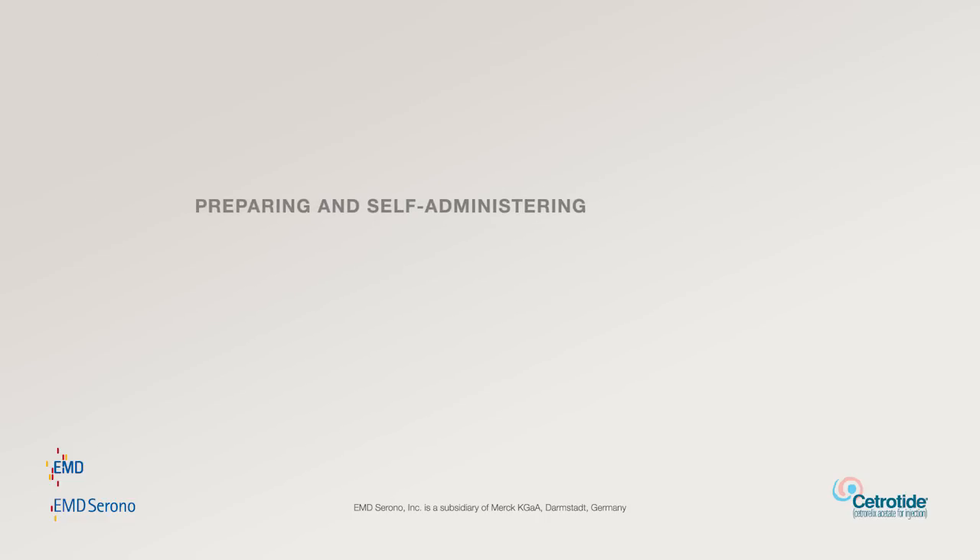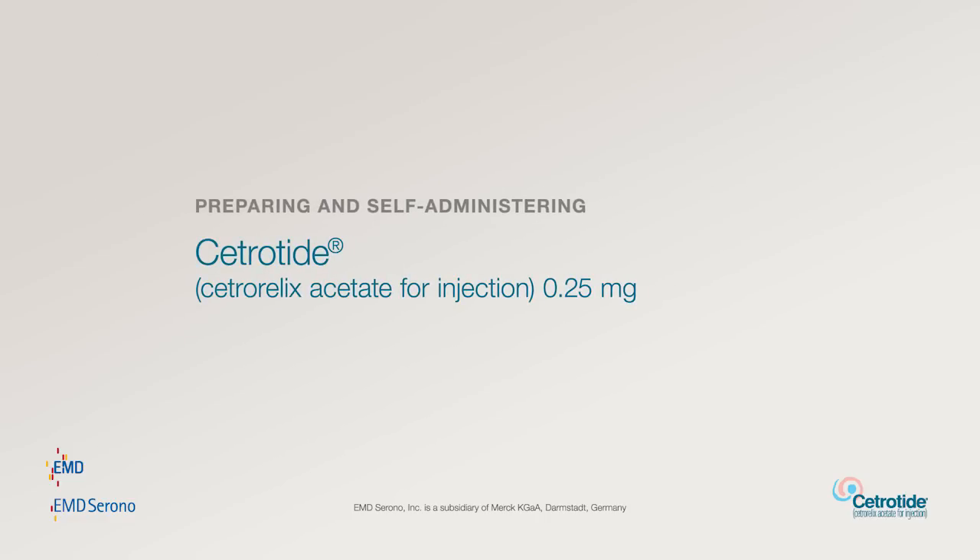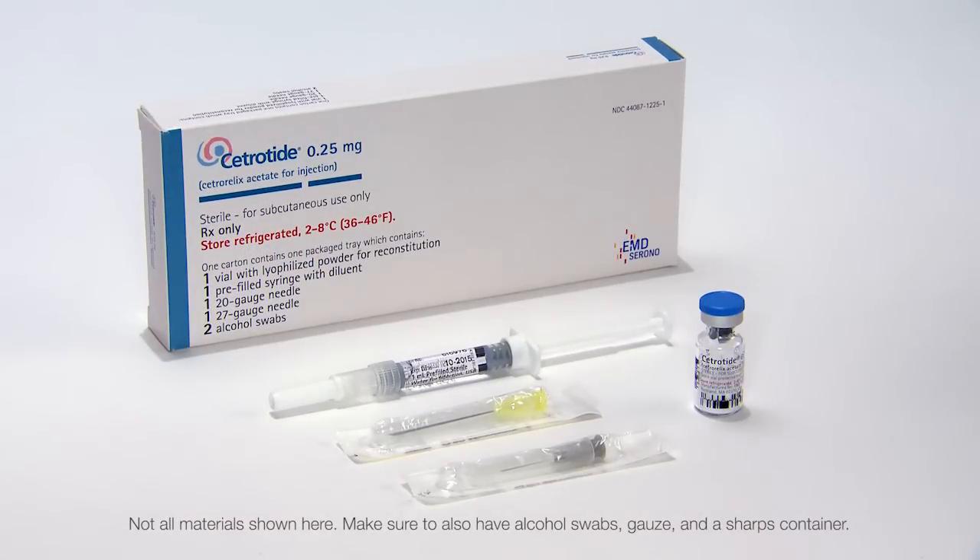Getting Ready. Make sure you have all the necessary materials assembled in a clean area: 1 vial of Cetrotide 0.25 mg powder, a pre-filled syringe of Sterile Water for Injection USP, 1 pre-filled syringe, and 1 yellow 20-gauge 1.5-inch mixing needle.